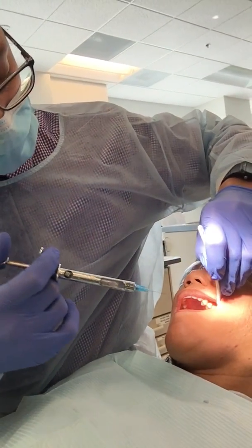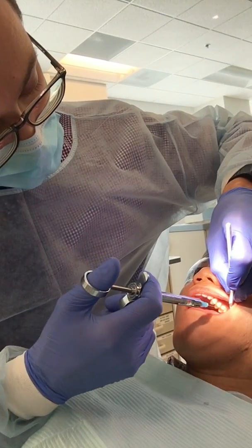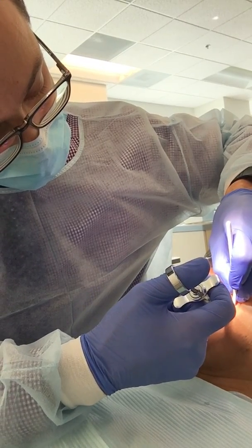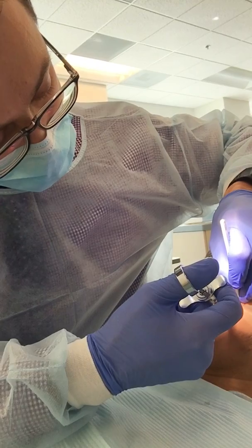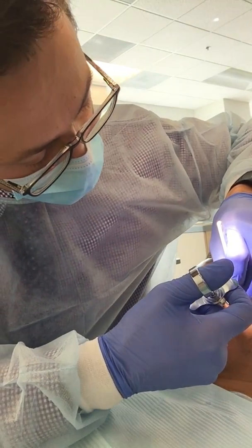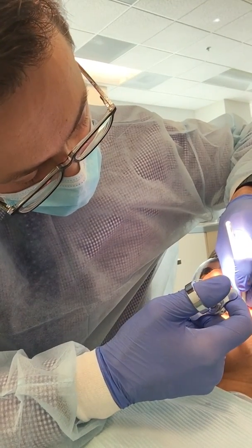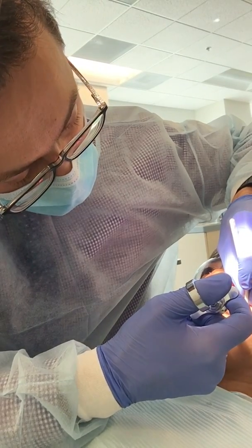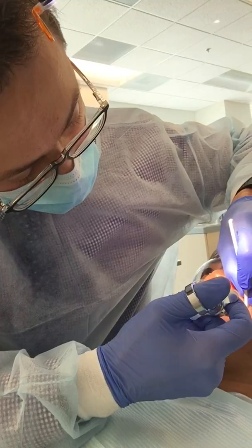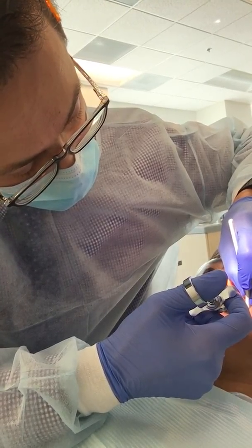Turn towards me, please. Just a little bit. Yeah, make it easy on me. Is that right? So about... yep. Here? Yep. Pretty close. Go up in the vestibule a little when you enter the tissue. Like here? Can you see? Yep. That looks good, right there. So I enter the tissue. And I'm in? Yep.